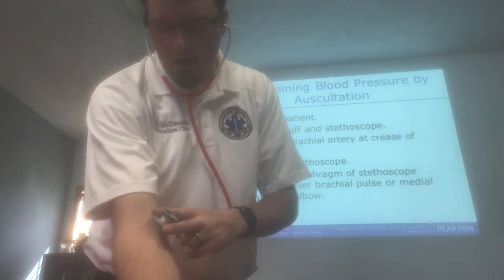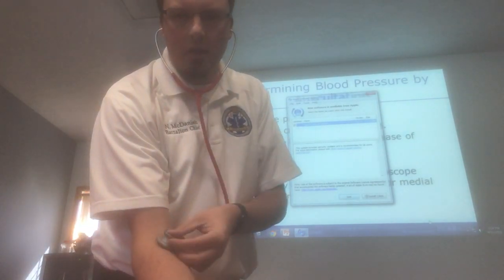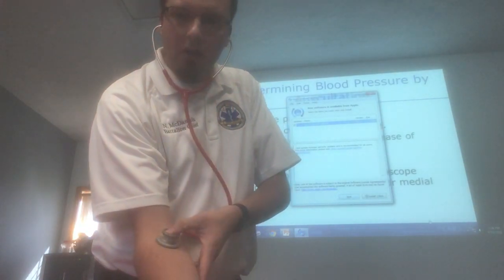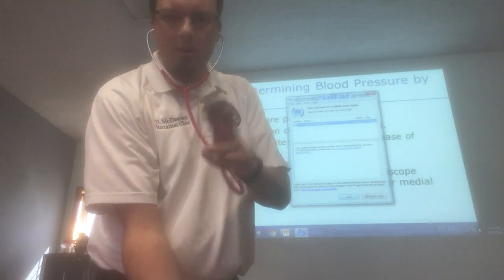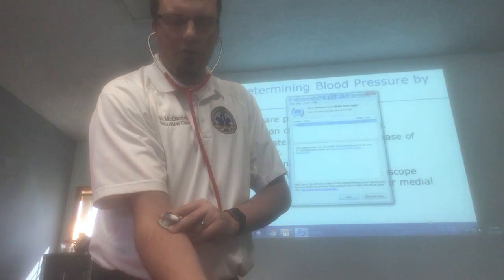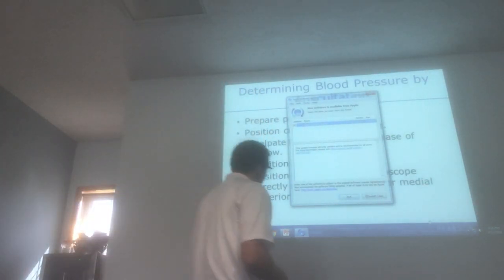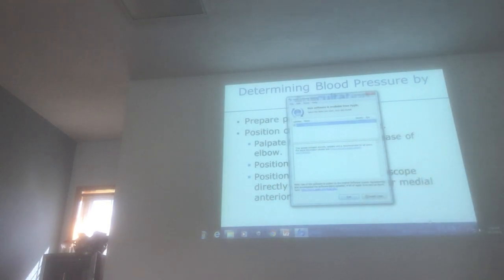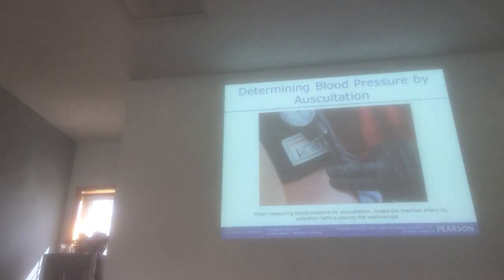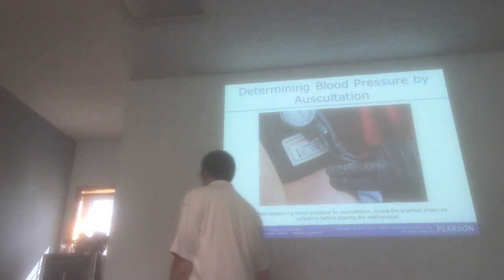Make sure when you hold it, you're kind of on either side of it. Place it down and put some firmness on that, man. We're not just touching it. We're not doing it like this so you can get the pulse of your thumb. Grab it, use your 2-finger technique, and then put some decent pressure down so you can actually hear it. There's a good picture of him holding that, trying to get a good pressure.